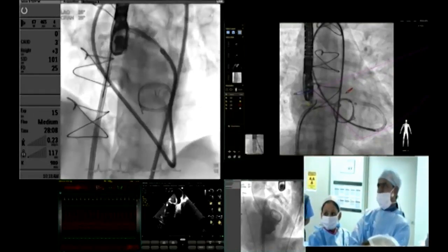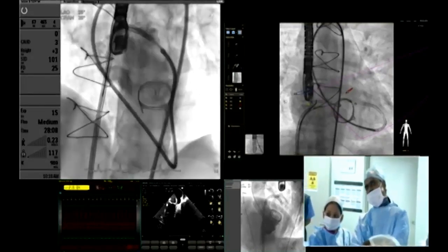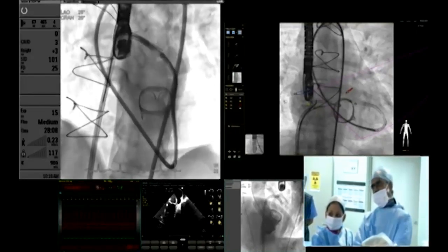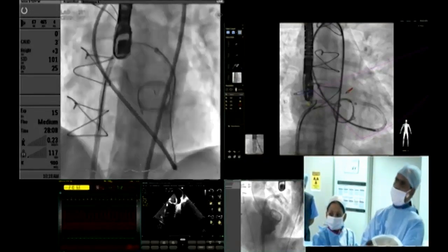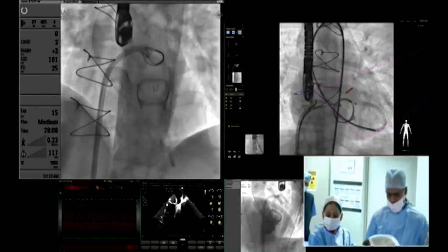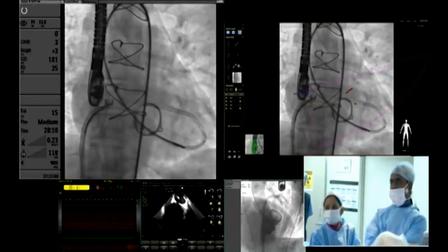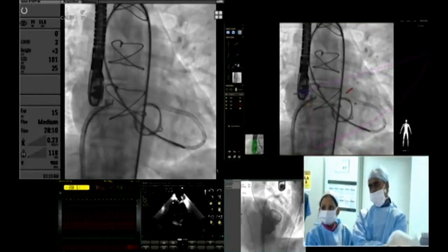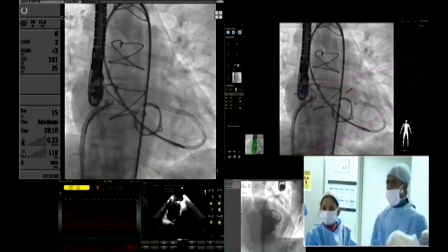Because this Agilis sheath is not easily crossing through — one more advantage of a retrograde approach is that I can position the device on transoesophageal echo guidance and see the left atrial disc. What we have is a transeptal sheath snaring the shuttle sheath. You can appreciate that there is already a kink in the shuttle sheath.